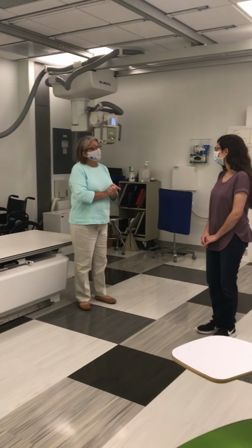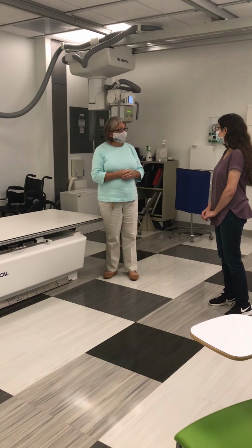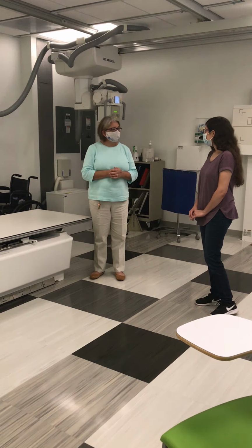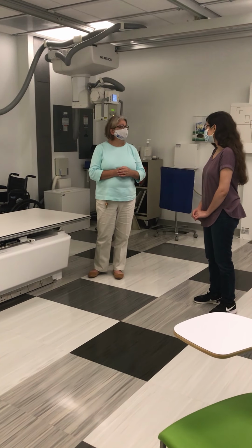Have our introductions. Hi, my name is Rebecca. I'm going to be getting an image of your abdomen today. Can you tell me your full name? Anna Kitzloff. And your date of birth? November 11th, 1998. Thank you. And is there any chance you could be pregnant? No. Thank you.